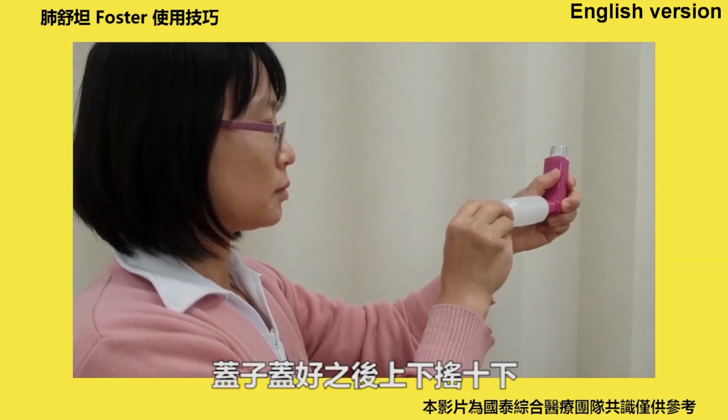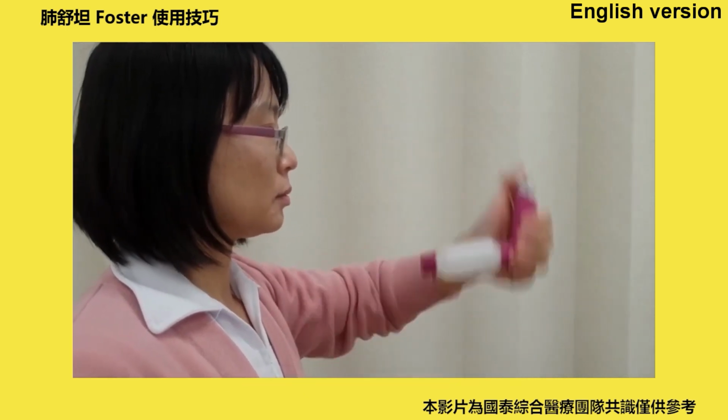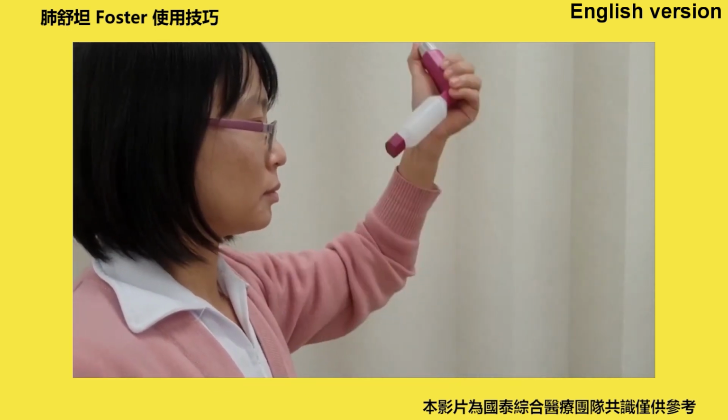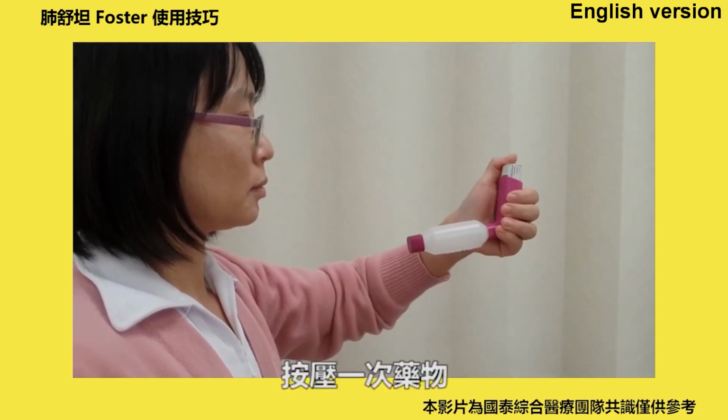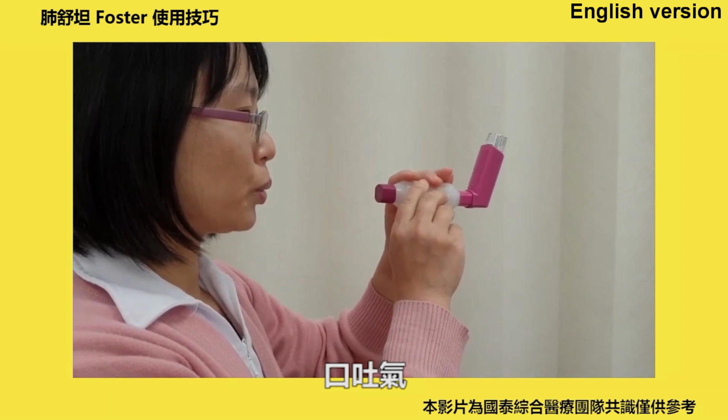Replace the mouthpiece cover. Shake the inhaler 10 times. Shake the inhaler well before each use. Press down the inhaler to release one puff of medicine. Breathe out gently and slowly away from the inhaler to empty your lungs until you feel ready to breathe in.